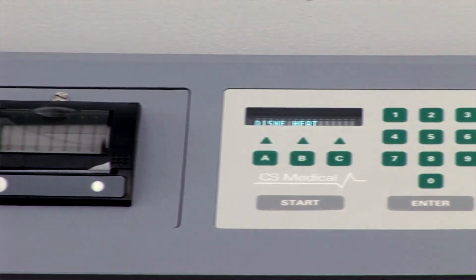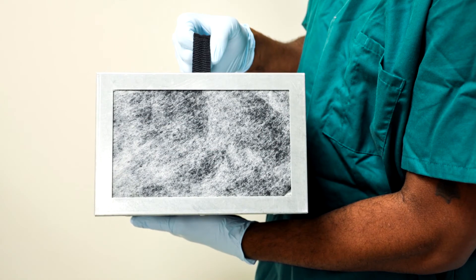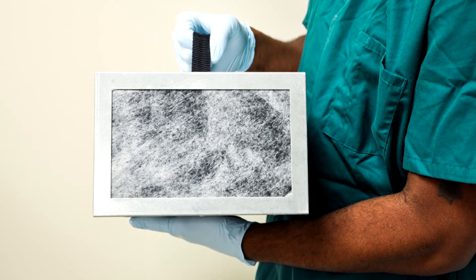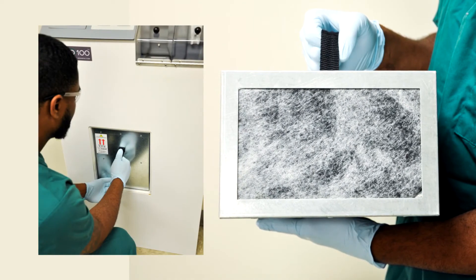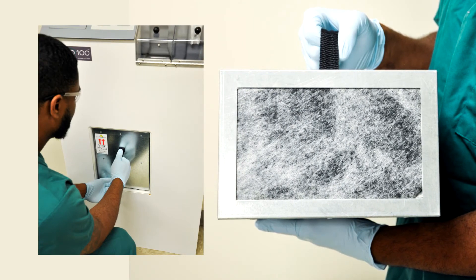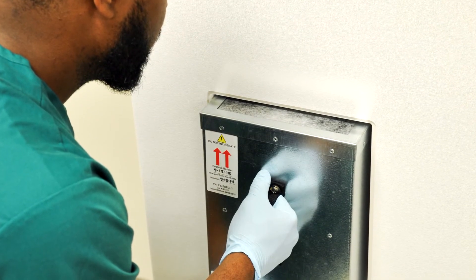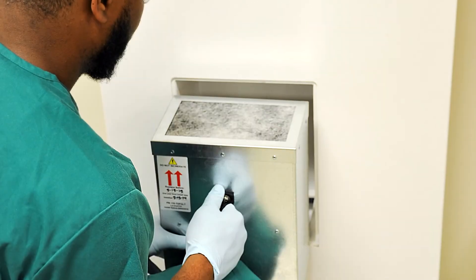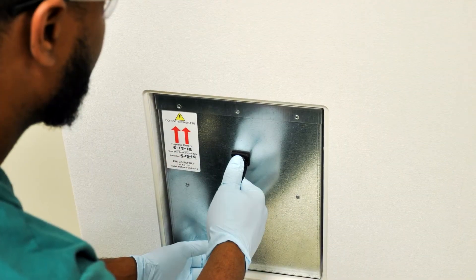The TD100 incorporates an advanced vapor management system that minimizes the potential for exposure to disinfectant vapors. The vapor management system utilizes a special bonded carbon filter designed to absorb and neutralize high-level disinfectant vapors. The filter is easily changed by opening the vapor management system door, pulling the saturated filter out, and replacing it with a new one.